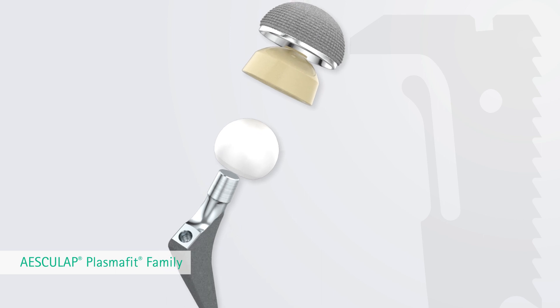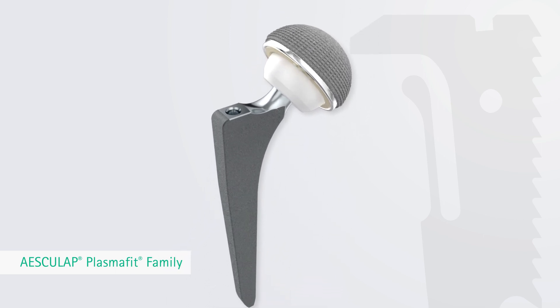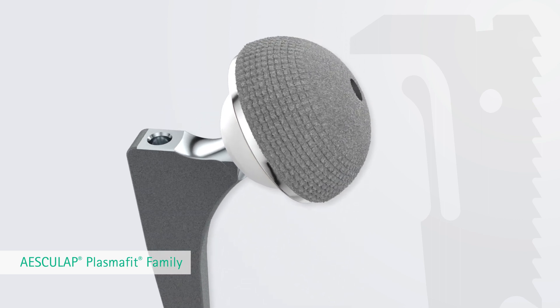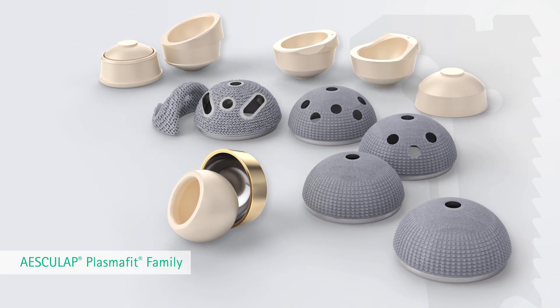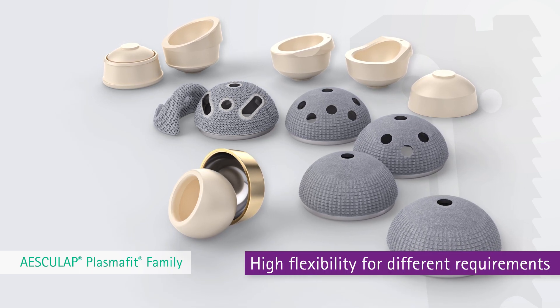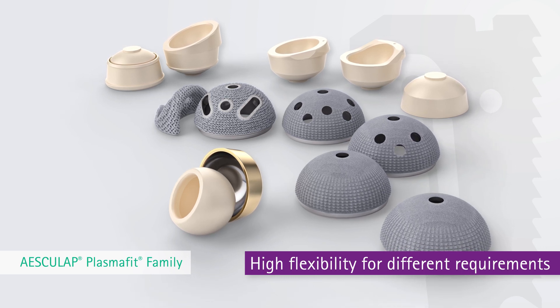The TRJ hip prosthesis stem can be combined with cemented and cementless acetabular implant systems such as the Esculap PlasmaFit acetabular cup system. The Esculap PlasmaFit family reflects a comprehensive solution for total hip joint replacements. Different requirements for patient-specific solutions are combined in one system and complement each other using the same instruments, design parameters and surgical procedure.